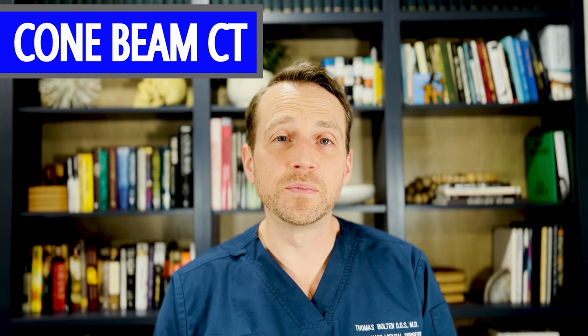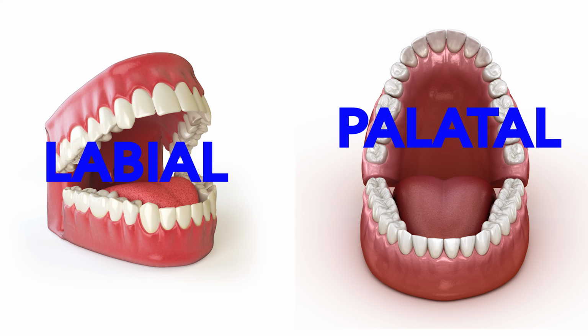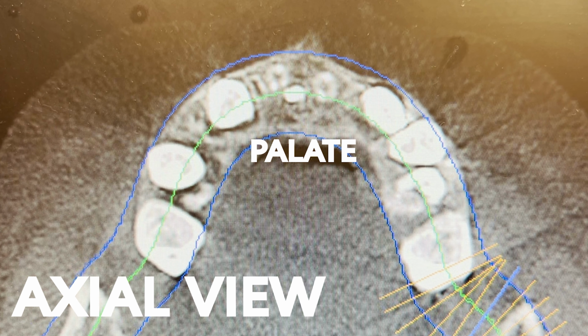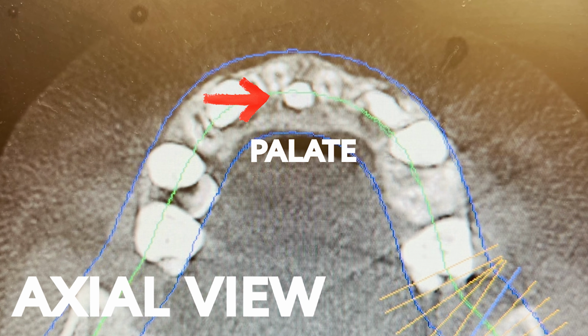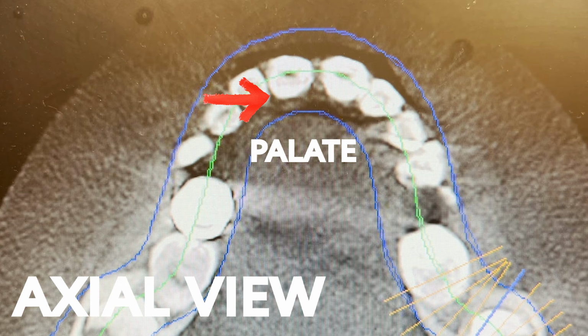The cone beam CT is important because I want to determine if this Mesiodens is oriented more towards the labial portion of the alveolar bone or towards the palate. On the cone beam CT, we can see that the Mesiodens is located palatal to the root structure of teeth 8 and 9, so I'll be approaching this with a palatal flap.